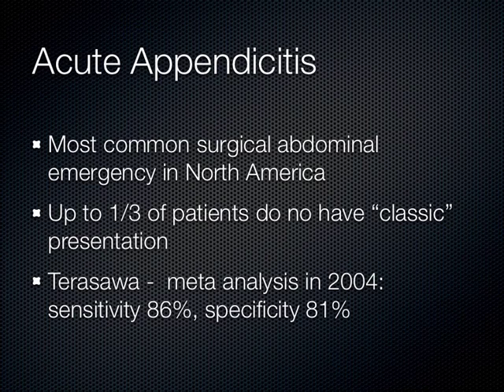I have patients coming in eating Cheetos who later go to the operating room for acute appendicitis, and the pathology specimen comes out positive for appendicitis. So I've seen a lot of atypical presentations of appendicitis, and that's where we have to turn to imaging. Now, CT clearly has the best characteristics here, but doing a CT scan is about 500 chest x-rays worth of radiation, and when you're young in life, your tissue is more radiosensitive, and you have a longer time in which to absorb radiation throughout your life, and radiation exposure to put you at risk for cancer is a cumulative effect, so we try to avoid unnecessary CT use, especially in patients less than 35 years old.